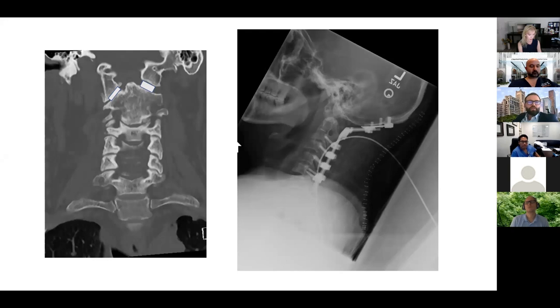In this patient, for instance, I used a cornerstone bone allograft, shaved it a little bit and put it in, because these are different sizes, so you have to shave it and tailor it. Some people use shims, the ones that Atul Goel and Vincent Traynelis use. I don't use those. I usually use bone allograft, usually cornerstone or some alternative cortical cancellous bone allograft.